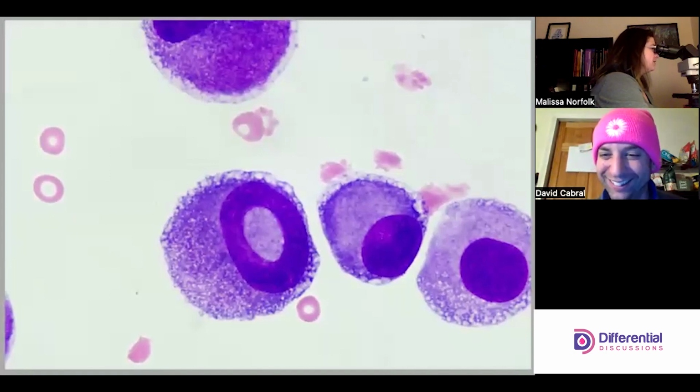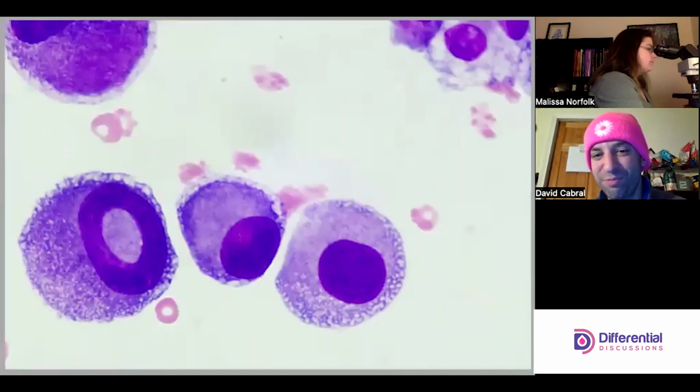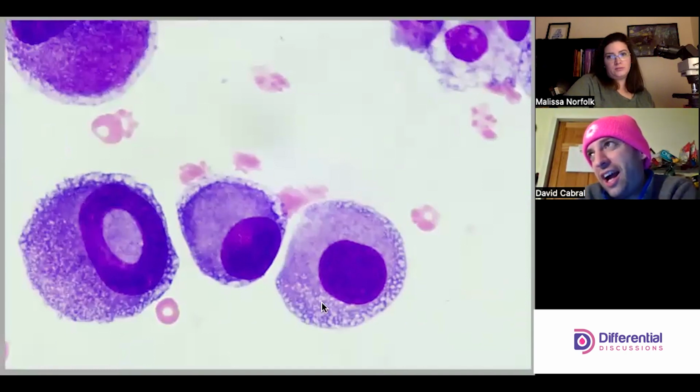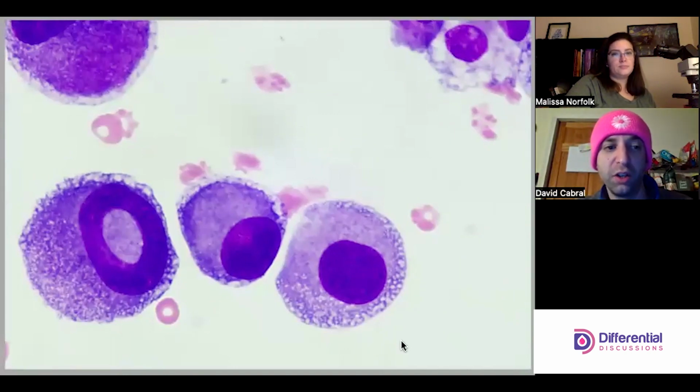Yeah, good. So just looking at them. So now we have this guy here with these two here, just comparing them. So I think I'm in the position where once I've seen a malignant cell, I get really heavy on that malignant cell button, whatever that might be, right? So the term that we typically use for a cell like this is a large unidentified mononuclear cell. And that's really just slang for like possible cancer, right? For us. So that's what I would say for these three.